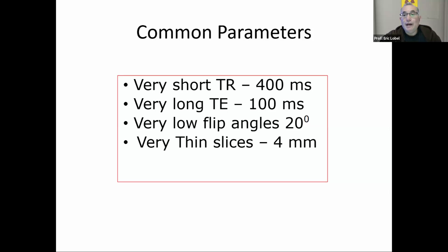A long TE is always pretty much shorter than TRs anyway. And that kind of makes sense because if you remember the pulse sequence diagram, and we're going to see some more of them today, you'll notice that the TE is always embedded within the TR. So you have the excitation to the next excitation, but right after the initial excitation pulse, not long after that, I should say, you get your TE, which is your time to echo.